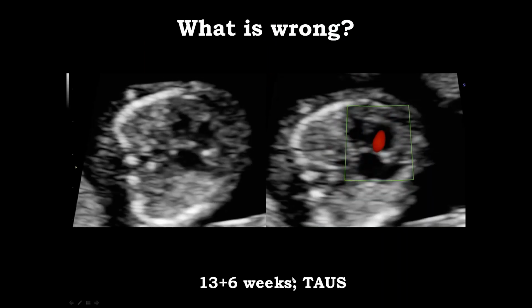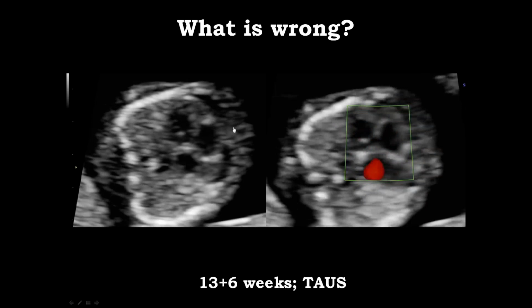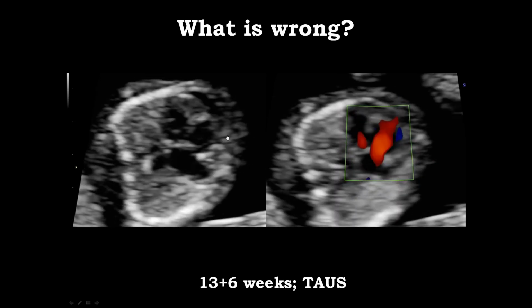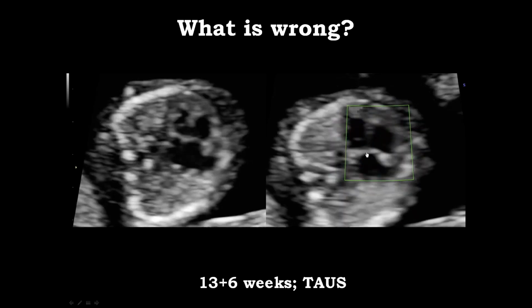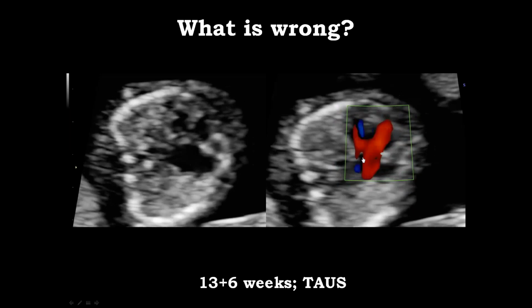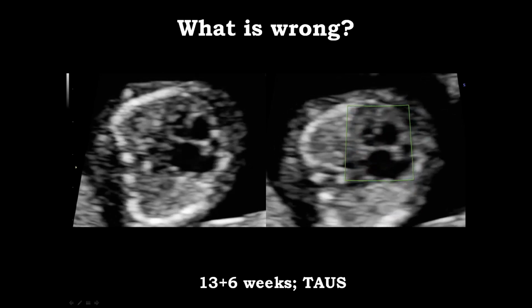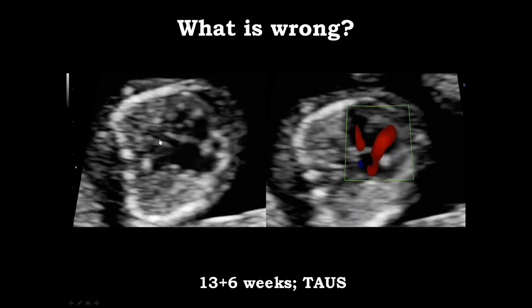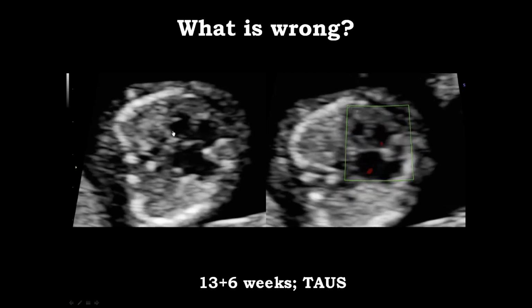So let's take a look at those clips. What's wrong here? Here we are looking at the size of the heart. It's definitely enlarged. We have tricuspid insufficiency maybe, but maybe just insufficiency in the middle here. That means that most likely we are dealing with a common valve. But what is also striking about this situation is that the heart rate is abnormal. It seems to be very slow, and it's not just a problem with the clip playing, this is a true abnormality of the heart rate.